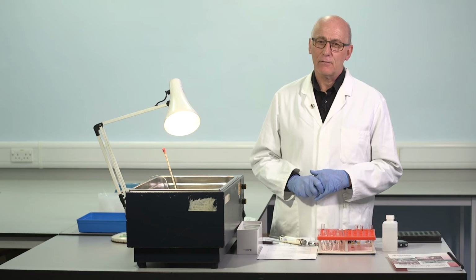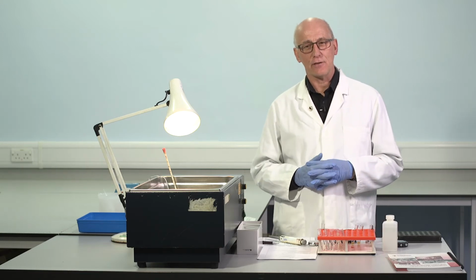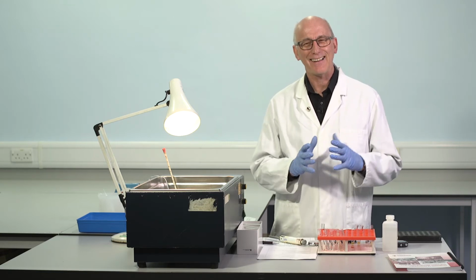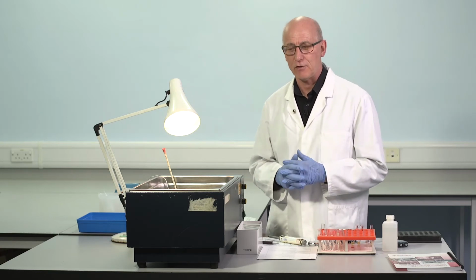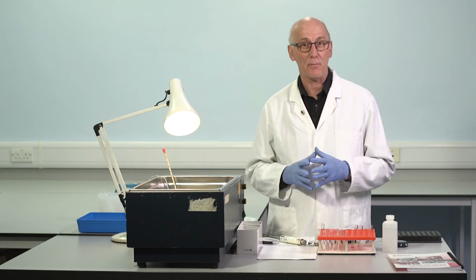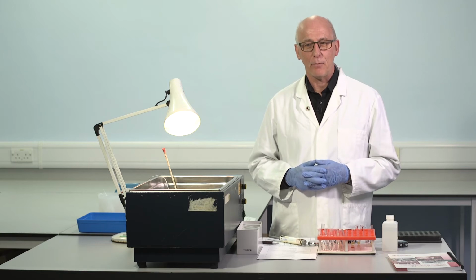I think this is not good practice. And for the reasons that we'll discuss in a moment related to the patient sample, it's really important to do 3 dilutions of the patient samples. And I think in principle, the QC should always be treated in the same way as the patient sample. Then whichever are the conditions that apply will apply equally to both. It's really important to do this. 3 dilutions of patient sample.